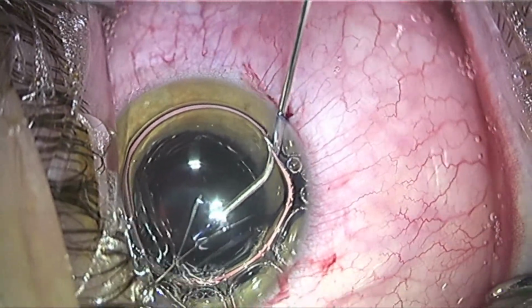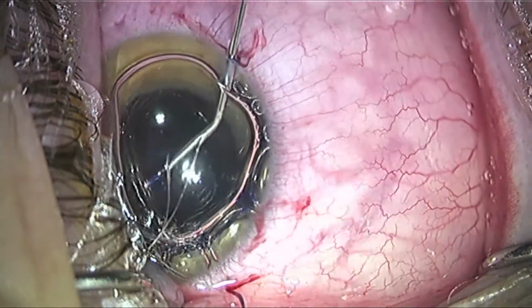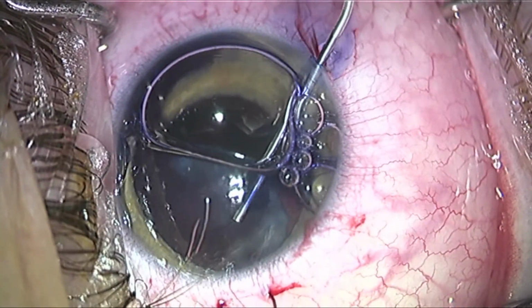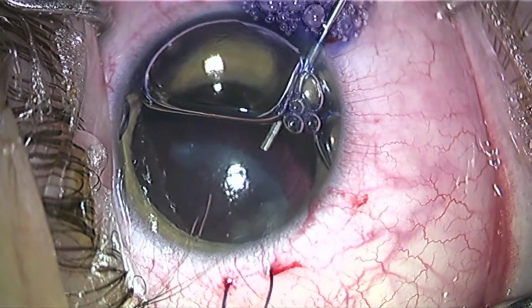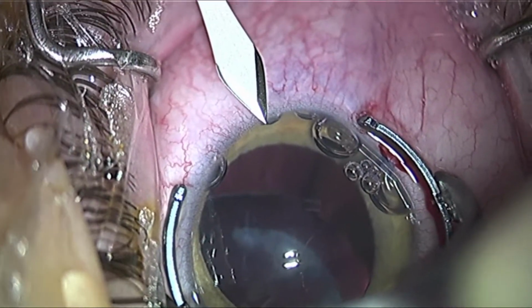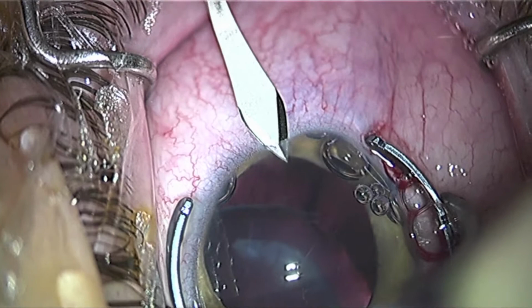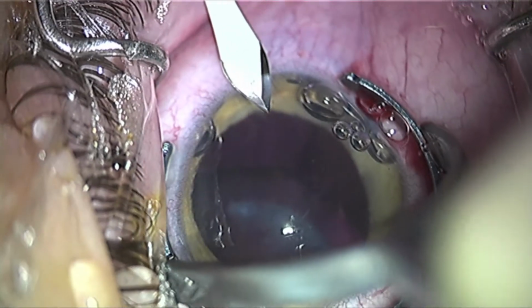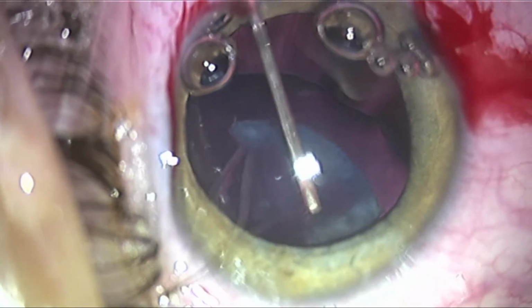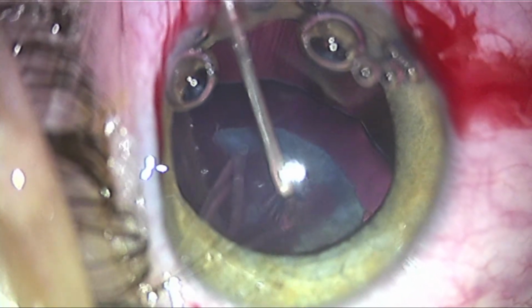We next placed trypan blue to stain the anterior lens capsule. Next, we placed a dispersive viscoelastic in the eye to displace the air and the trypan blue. A clear corneal incision was made, and then a capsulorhexis was initiated with a pre-bent cystotome.